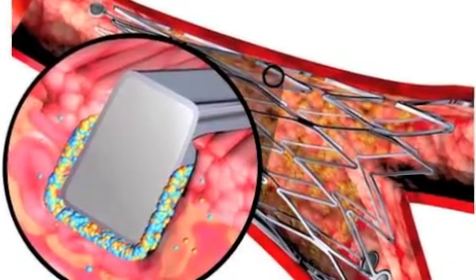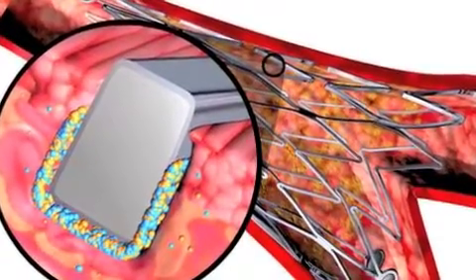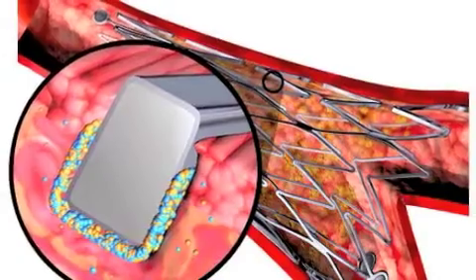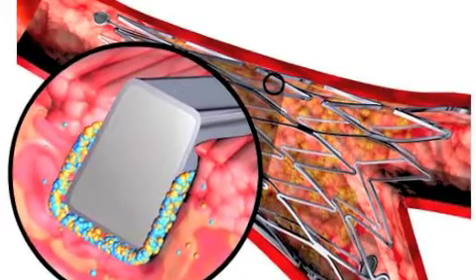If the physician feels as though ballooning would not be sufficient, there are two types of stents that he or she could use. The physician can choose from a drug-eluting stent or a bare metal stent. Once the physician has come to the conclusion that they'd like to place a drug-eluting stent, they would follow the same procedure as ballooning, the only difference being a stent is being placed.